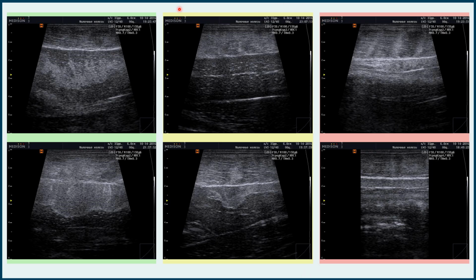As a matter of fact, the point I wanted to make is that it is important to consider such parameters as fish age, even approximate one, size and fatness while doing diagnostics. Based on these data you can predict for yourself at what stage of maturity the gonads may be, their approximate size and appearance, and respectively how they can be displayed on the sonograms. In this case, if the image on the scanner screen will be too different from your predictions, it makes sense to examine the fish more thoroughly. This is the end of our work session.